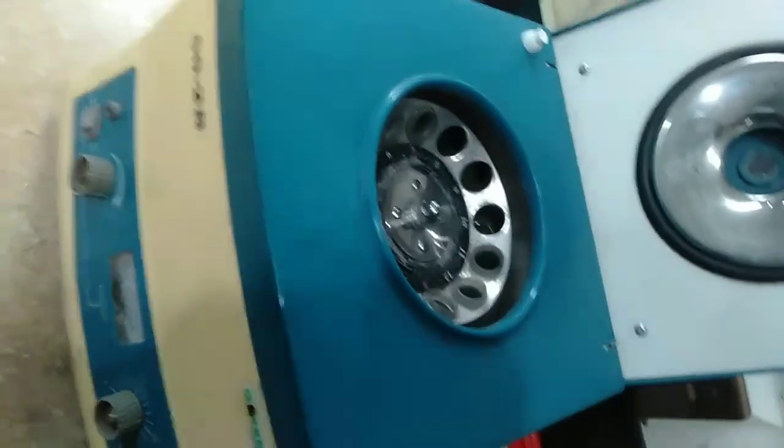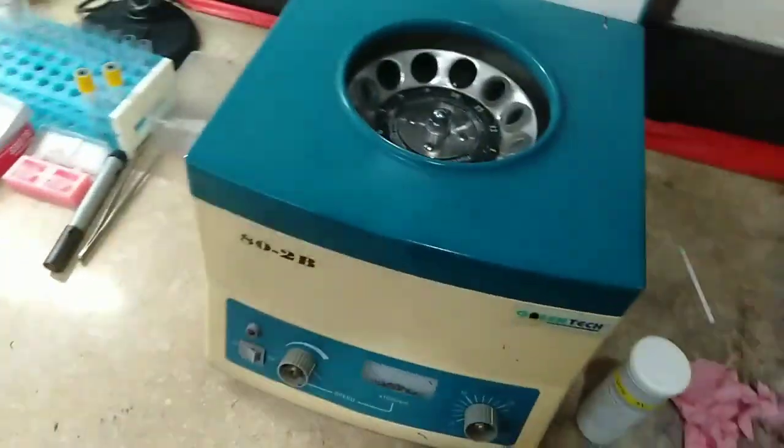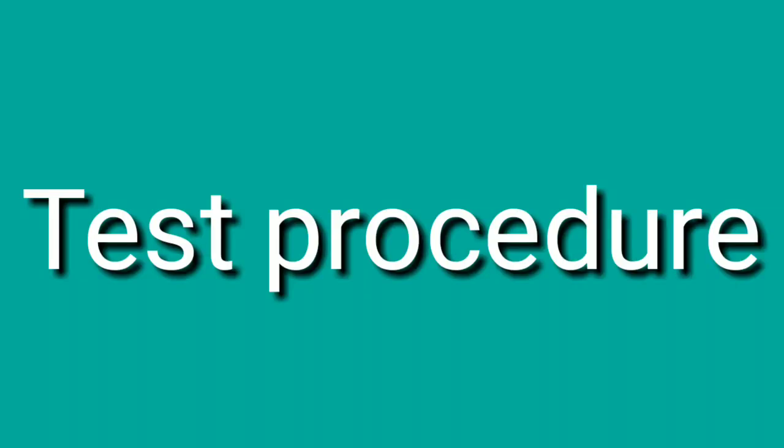It also contains a troponin buffer — this is the troponin buffer. We also require a centrifuge machine, as you can see.